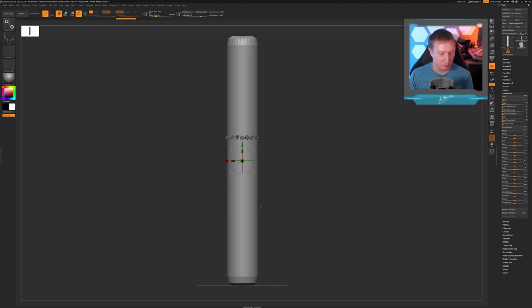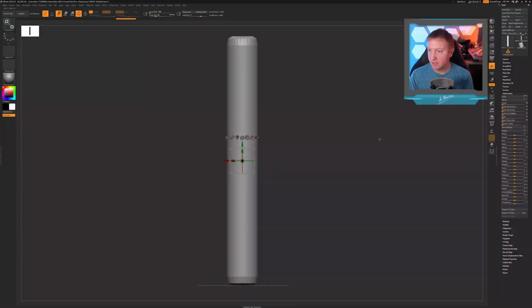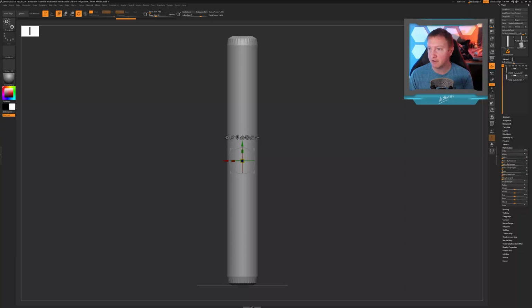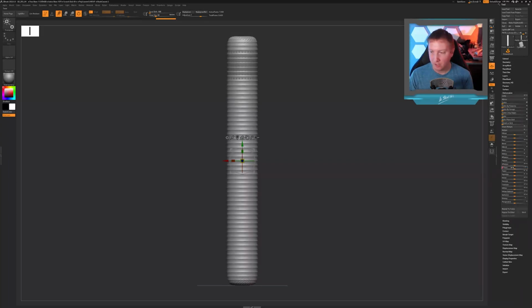Maybe we should divide this one more time. Let's go back and look at this screw and see how many threads are there. You know, that's about right. And I do have to make a variable thread pitch at some point, so maybe I want to give myself a few extra threads. So let's divide this one more time. I'm going to come into my geometry menu and divide this one more time. I'm going to delete those lower orders, go back down to deformation, and twist this thing up again. All right, so probably too many threads here, but that'll give us a little bit of room to work.